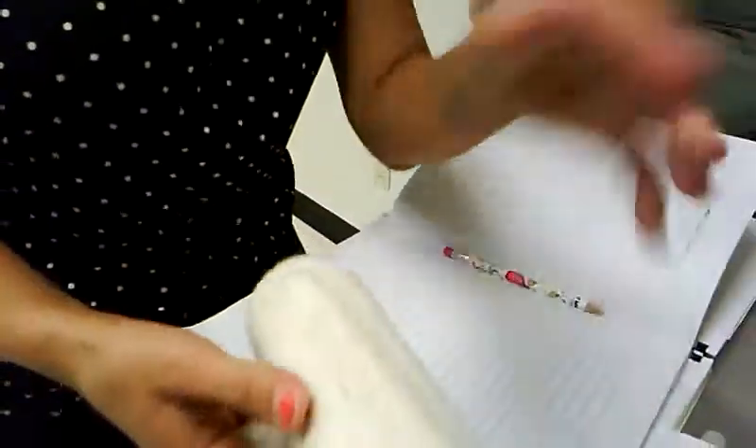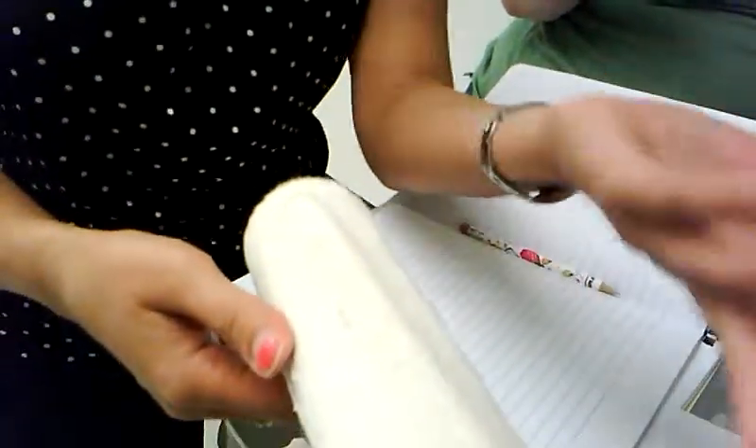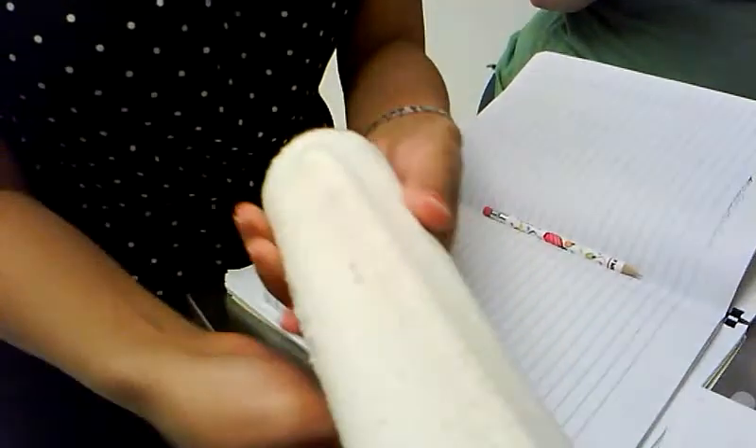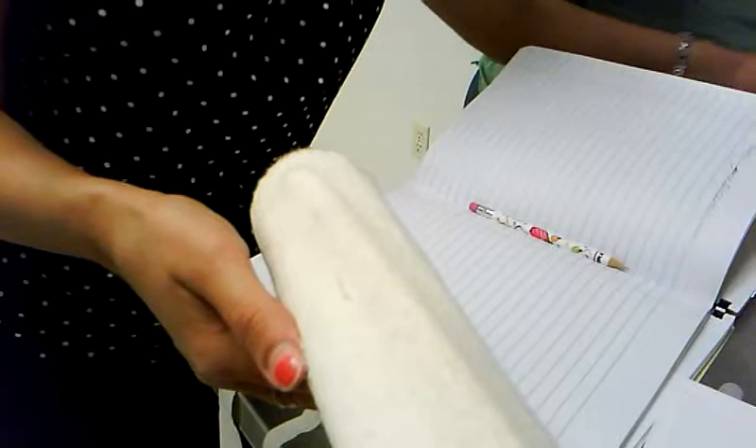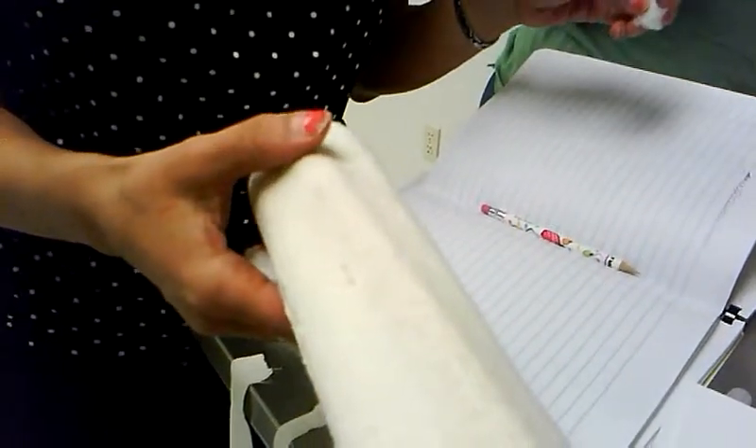Do I have to show you everything? Cleaning. Shave it first. It's shaved, but you have to shave it. And then clean it one time with alcohol, the second time with scrubbing.